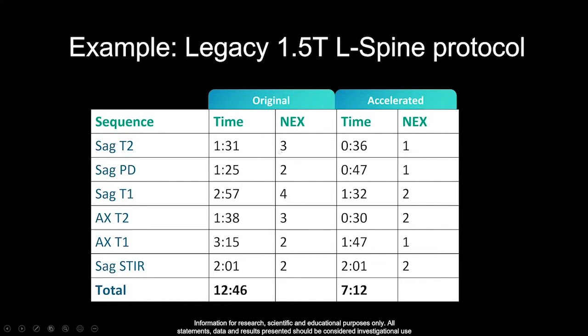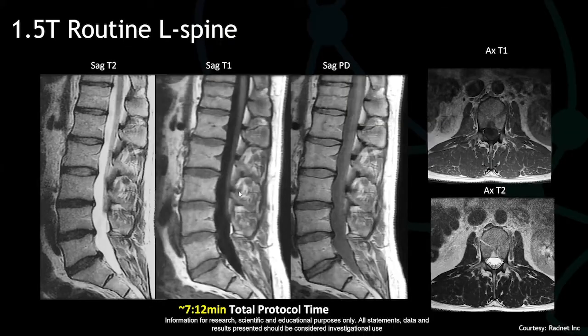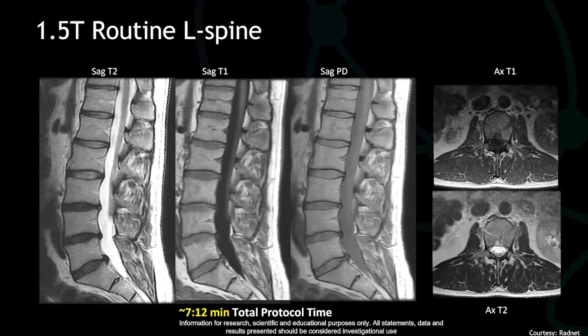And you can see that this is a lot faster than we did beforehand. So how did we accomplish the image quality that we had before? Well, we can use these tools to take this type of quality. You can see it's got a little low SNR, a little noise, it's just not an ideal image. Even though we've achieved our clinical goal of a 20-minute exam slot, we can actually use these tools to bring the quality back. Again, still maintaining that exam slot, but maintaining the quality we're expecting.